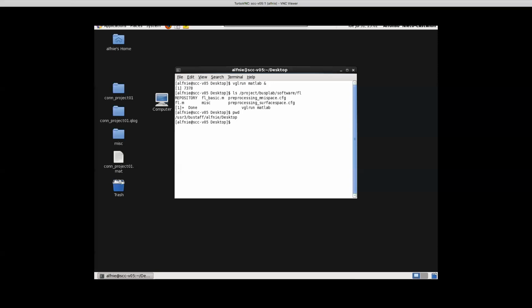It's still looking at the same surface at the subject level. It's actually telling you that when you inflate that subject level into a sphere, you will get a match between every location of every vertex within that brain. So it's trying to match the gyri and sulci location of the nodes within your tessellation of the subject-specific cortical surfaces, so that when those are inflated into a sphere, they look similar across subjects. Does that make sense? Does that answer the question?